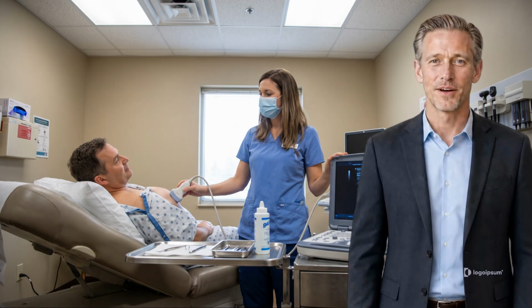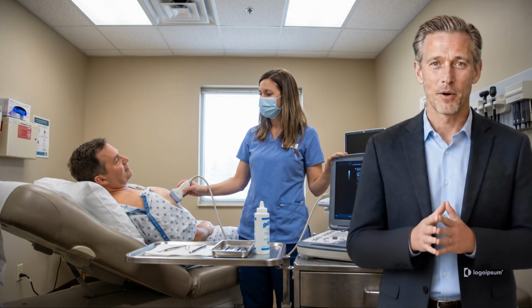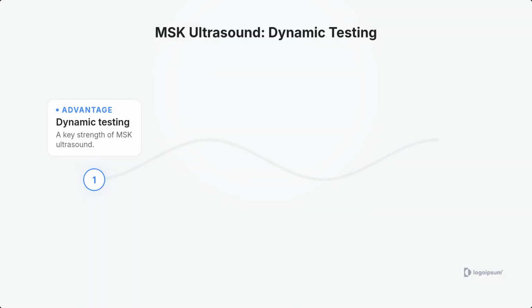Unlike scans where you must lie completely still inside a tube, an ultrasound allows you to talk directly with your technologist and point out exactly where it hurts. The technologist glides a small probe with warm gel over your joint to look at muscles, tendons, and ligaments in action. One of the biggest advantages of MSK ultrasound is dynamic testing.